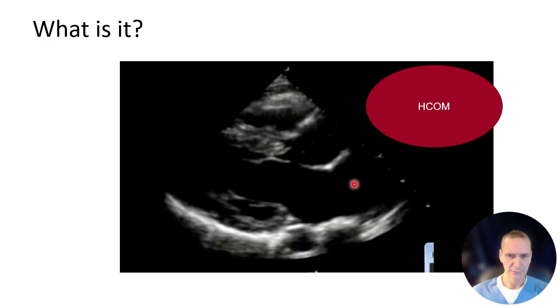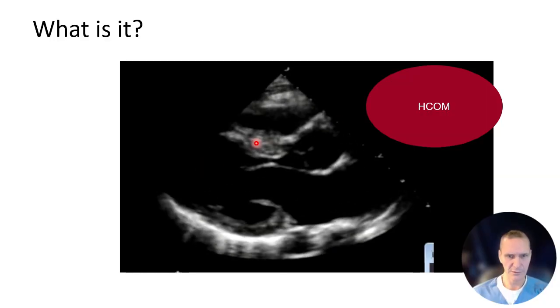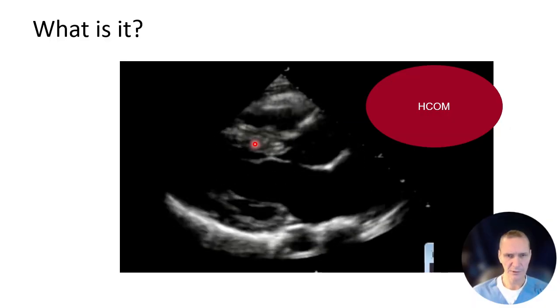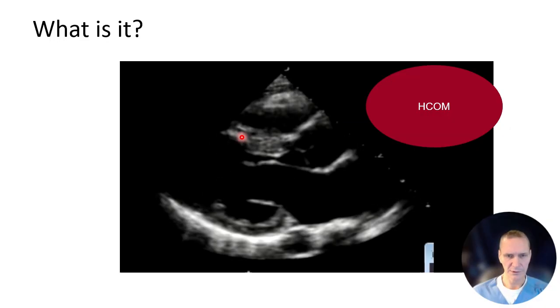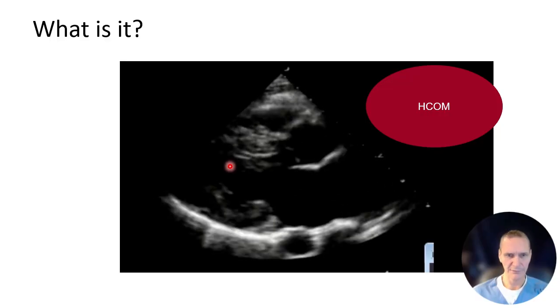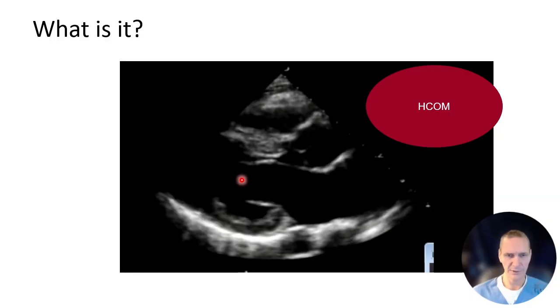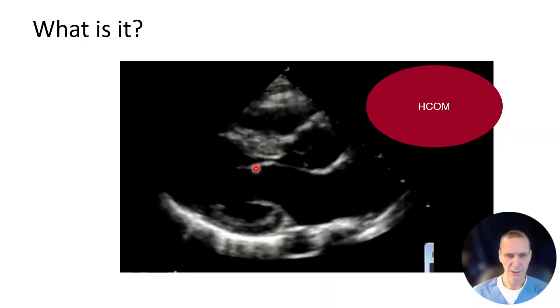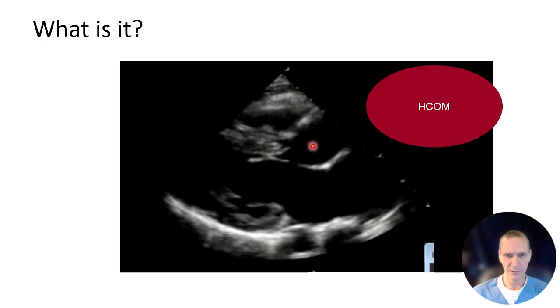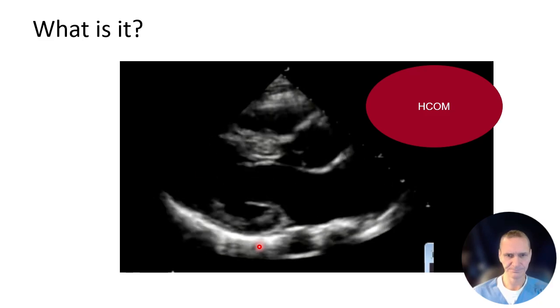Left atrium, going into the LV, the aortic outflow tract, the right side of the heart. You look at the septum, it's quite large. Remember, when you have hypertrophic obstructive cardiomyopathy, you want to slow the heart rate down and give them volume. The reason you do that is you want the LV to be large and open, because what can happen is the anterior leaflet of the mitral valve here can become wedged in here. So this is HOCM.